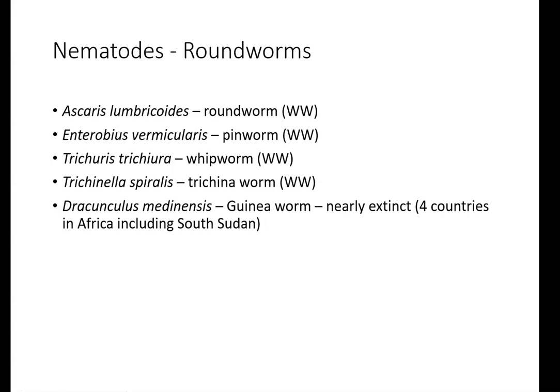Nematodes. Oh, before I go to nematodes, sorry. Sometimes we get things other than stools in. So sometimes you'll get duodenal aspirates or urethral or vaginal specimens. Like sometimes we get those wet mounts that we would be looking for yeast and things, and sometimes we see Trichomonas vaginalis in it. Well, that's a protozoan. That's actually, you just identified a parasite. Okay.